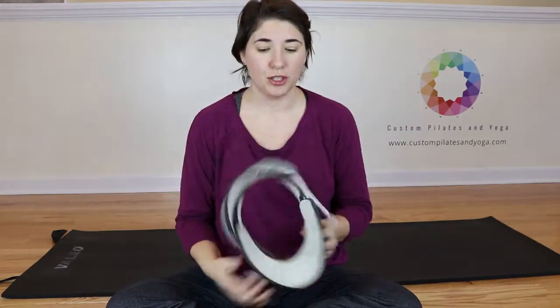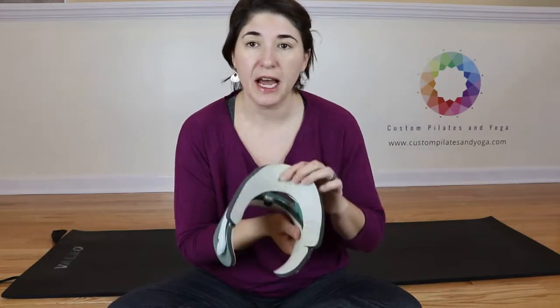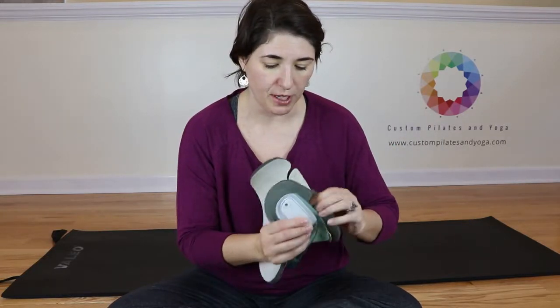So there's how to get it back on and how to adjust it. And I'm going to show you also how to change the pads. These pads are secured on here with Velcro.